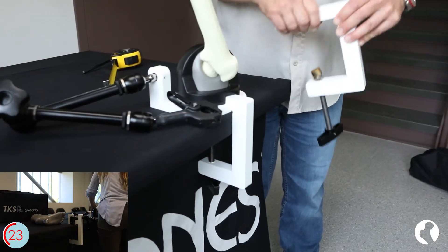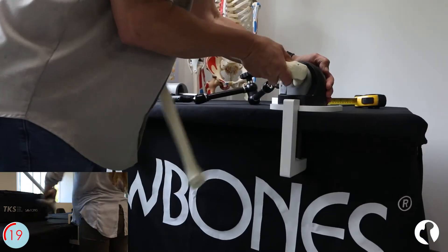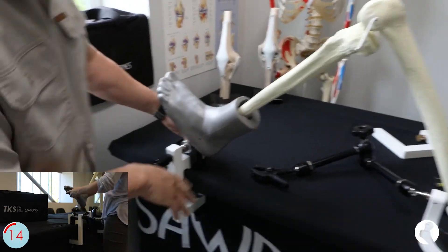To set up the TKS, secure the acetabular holder with the pelvis clamp and secure the foot clamp and soft tissue foot. Insert the femur into the acetabular holder and the tibia into the soft tissue foot, adjusting angles and spacing as needed.